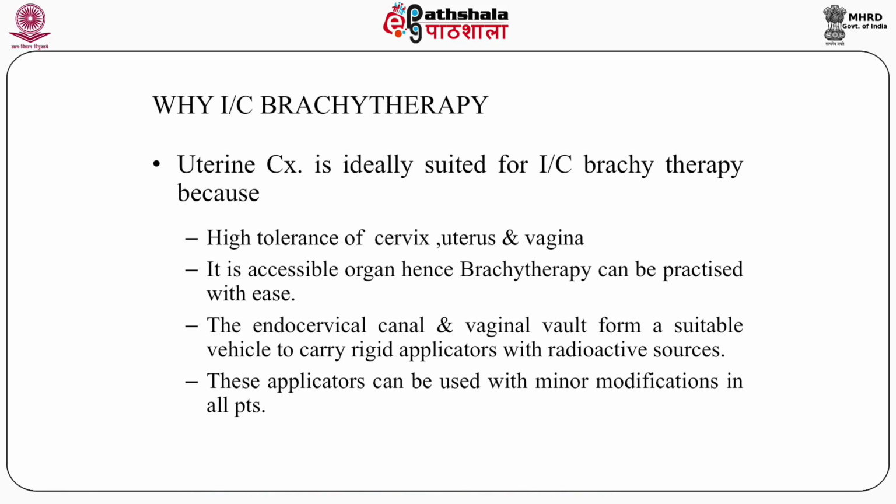In the case of carcinoma cervix, nowadays very thin applicators are used, which can be fixed in the cavity very conveniently, and very small sources of approximately 3 mm to 6 mm are used. They can travel very conveniently in the applicators, and treatment is very convenient nowadays.